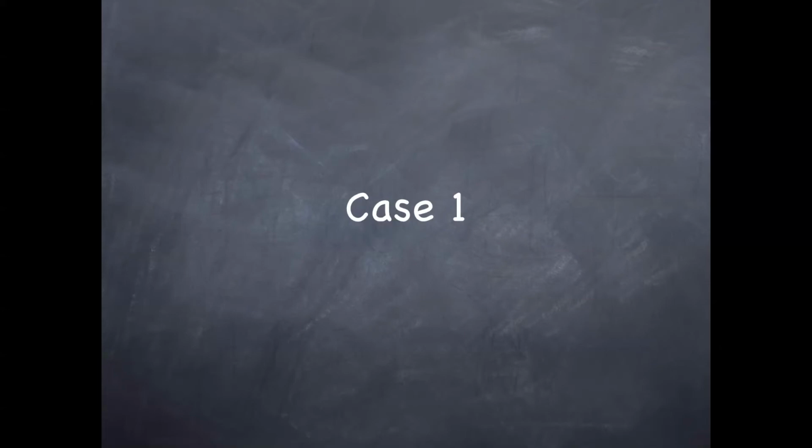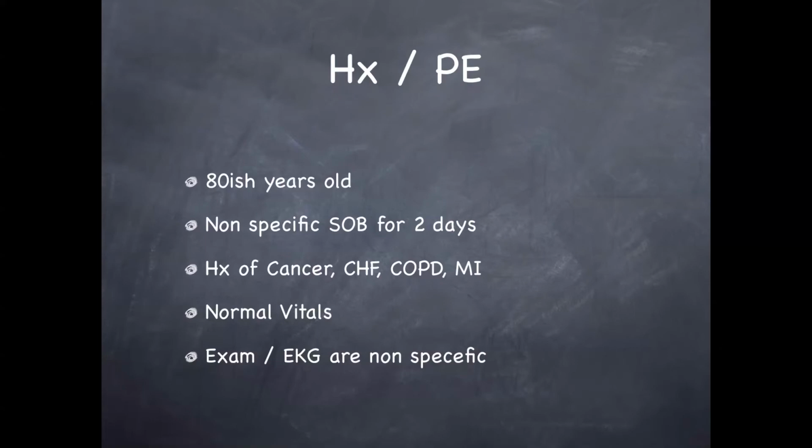So the first case occurred when I was doing educational scans with some of the PAs here at MGH. Both cases, the history is pretty vague on purpose. They had complex medical history. They were short of breath. And by EKG, by vital signs, by history, by the physical exam, by testing, you're not really sure what the diagnosis is. And so we were asked to do an ultrasound.